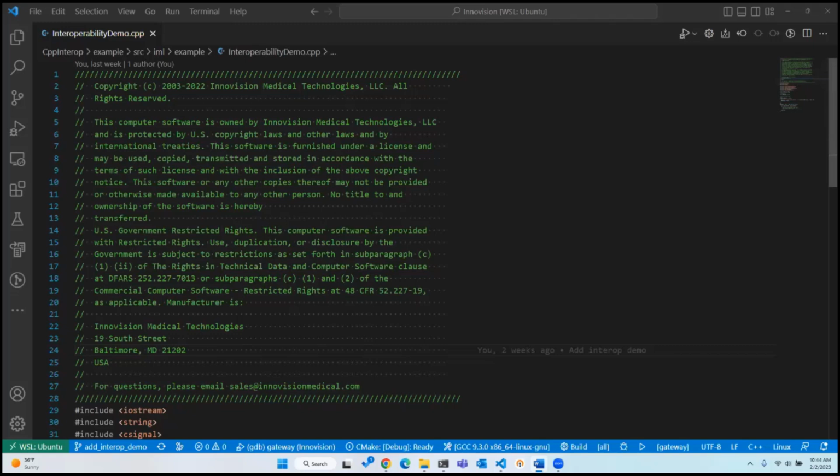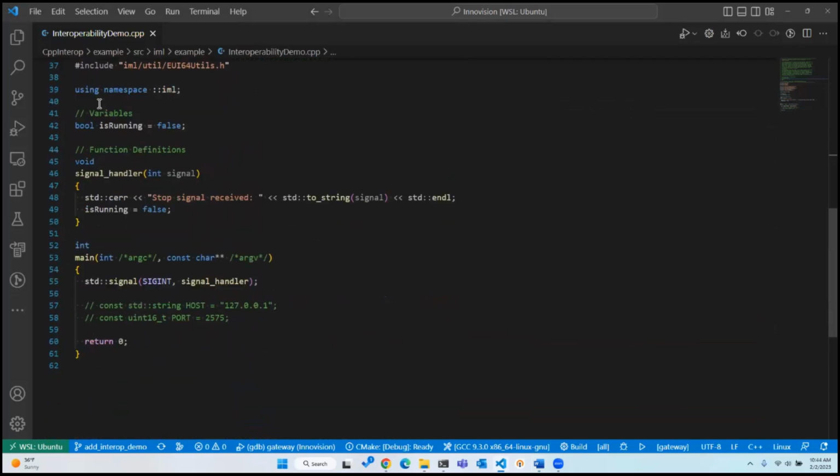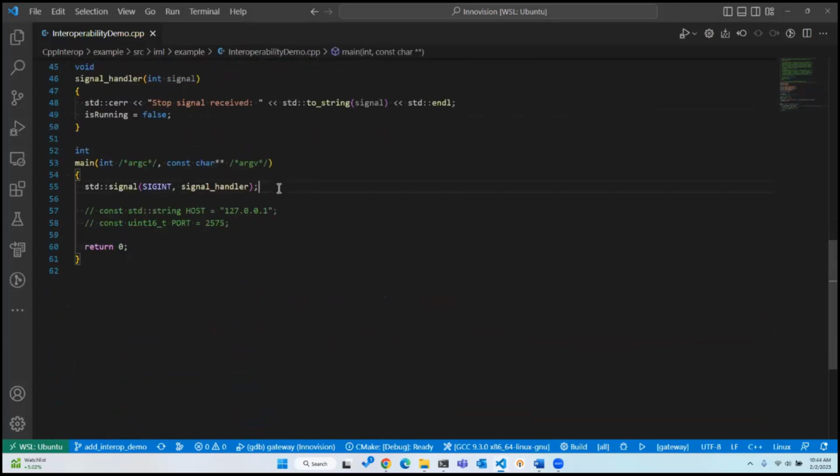So here in front of us, I have on screen a small demo program. This is our legal comment. And then here I just have some pre-included headers, so I don't have to include those during the demo. I have a global Boolean variable here, which will help me to halt the program from the command line. I have a signal handler defined, which allows me to halt the program from the console, as I said before. I have the signal defined right here. I'm going to use Control-C.